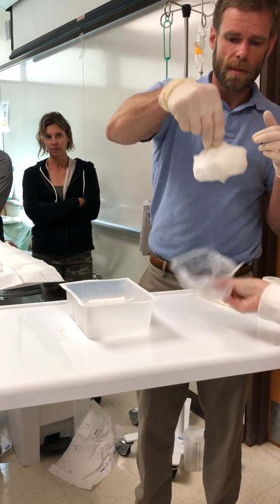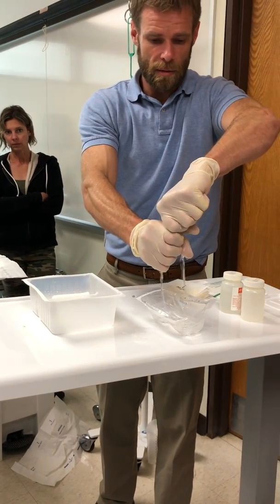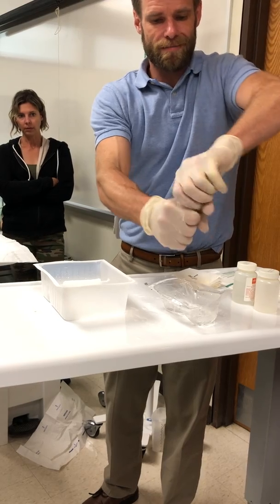Thanks. Set it down. Now, I'll try my best not to make too much of a mess, but we make messes. And guys, I don't want to do it over top of the sterile drape, because if the sterile drape gets wet, guess what? No longer sterile.